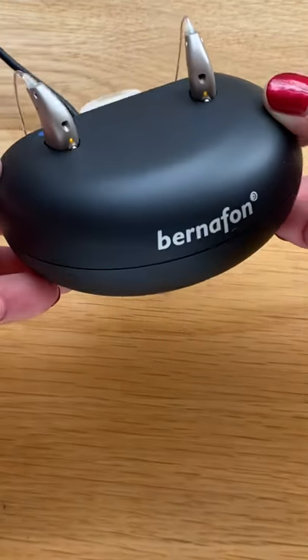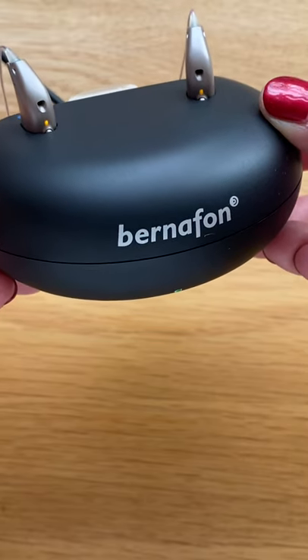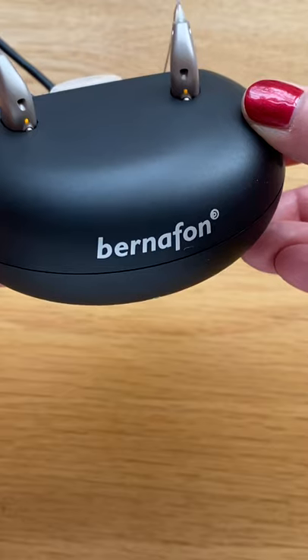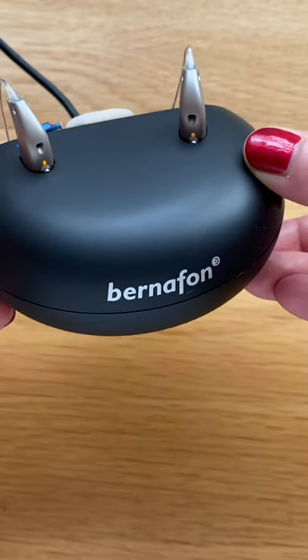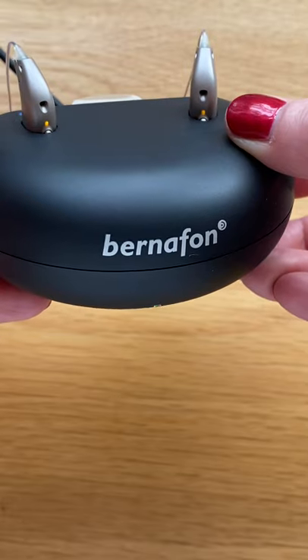We will now see two amber lights. This indicates that the instruments are docked and beginning to charge. When they are fully charged, both of these lights will turn green and you are ready to go.